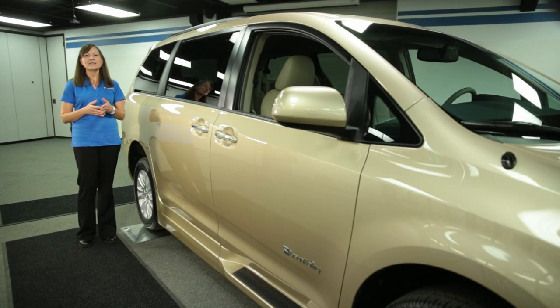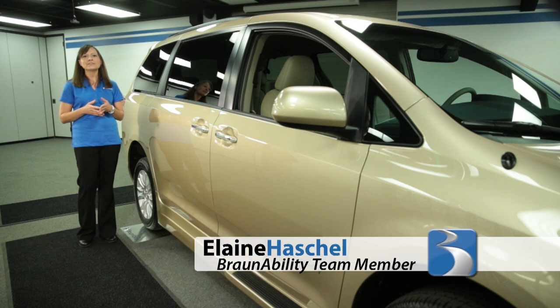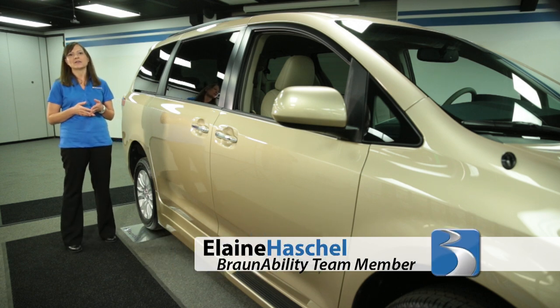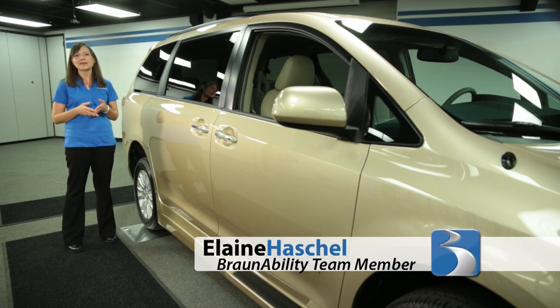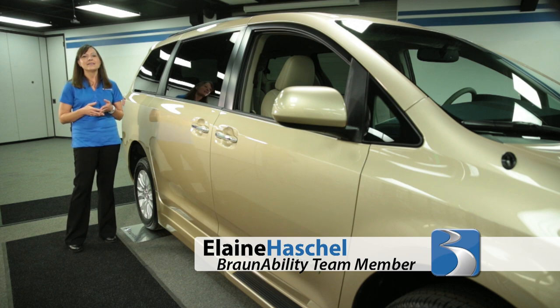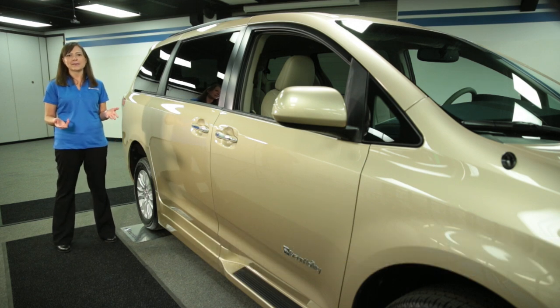The fold-out ramp has been a reliable workhorse ever since the very first lowered floor vehicle was built by BraunAbility in the early 90s. There's plenty to love about this fold-out ramp.